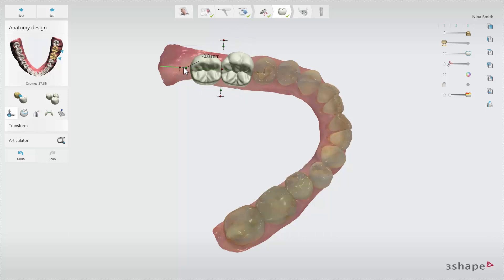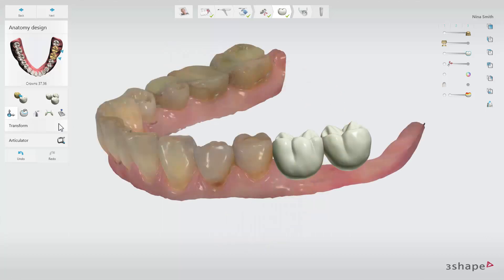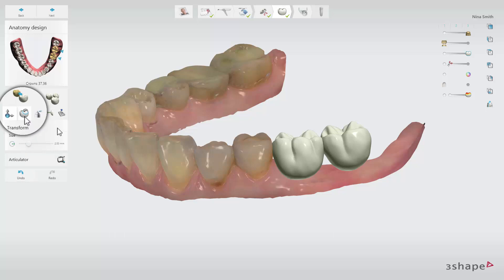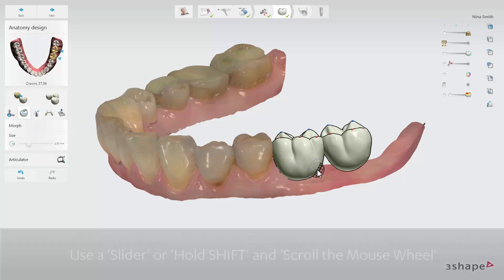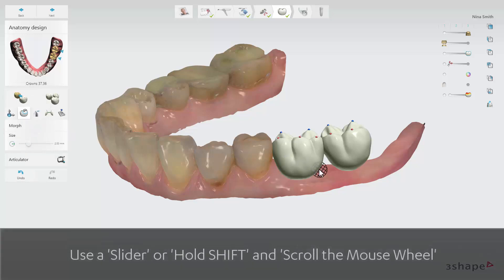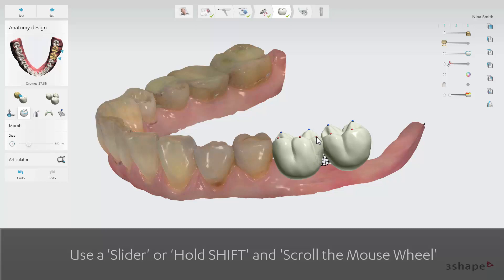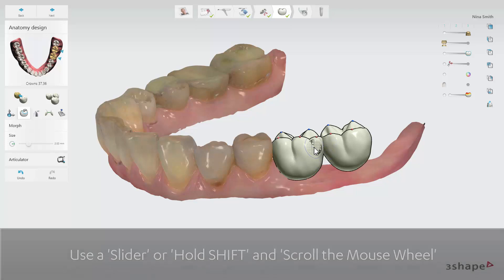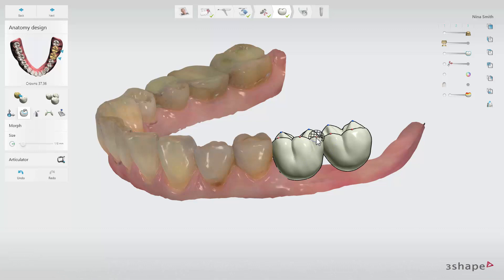Use the control handles to adjust the size of the crown or its position in any direction. To make adjustments to the tooth anatomy, click the Morph tool. Here you can adjust the size of the area on the crown you wish to influence by holding down Shift and then using the mouse wheel to scroll. Click and move the mouse on the surface of the tooth to modify it.